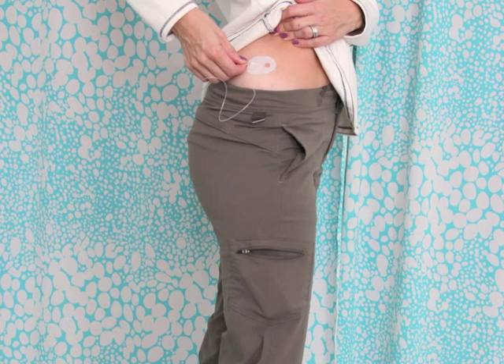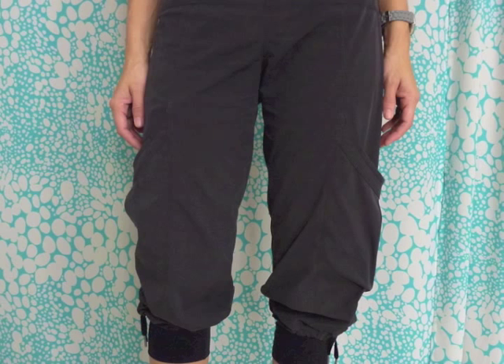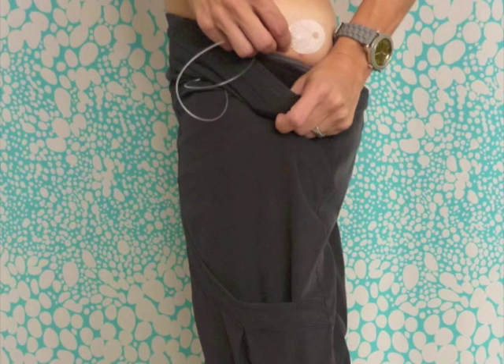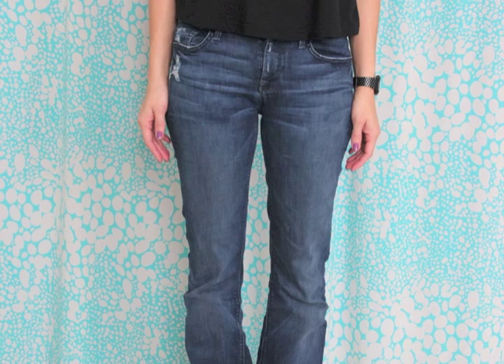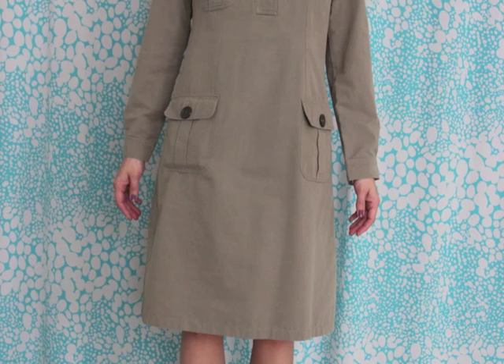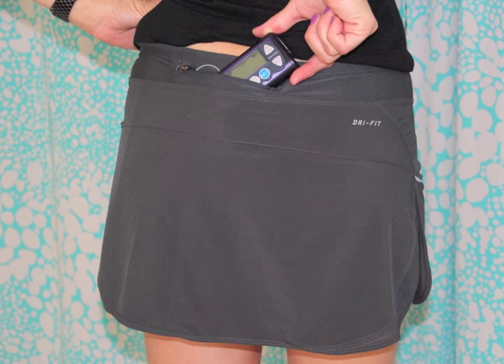The pump is in the pocket and it is easy to reach when you have to bolus. You can apply this tip to different kinds of pants with large pockets using the instructions I gave you before. You can hide your insulin pump with practically anything that you wear without having to have your pump visible but handy enough to bolus when you have to.